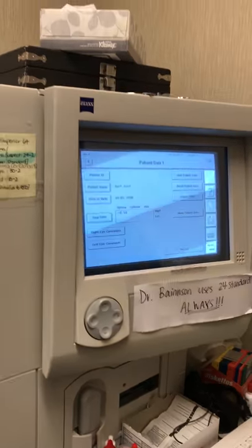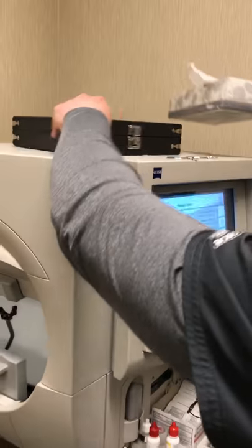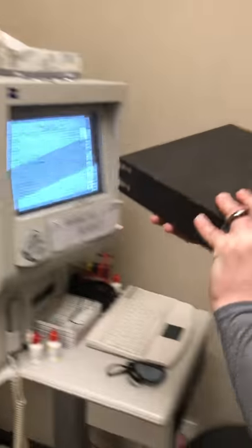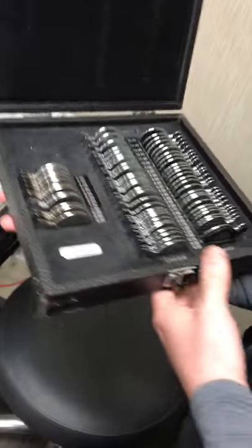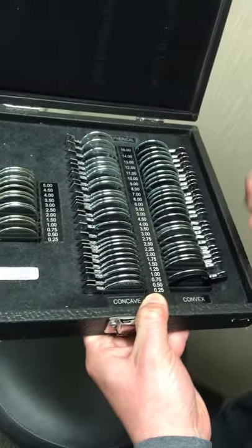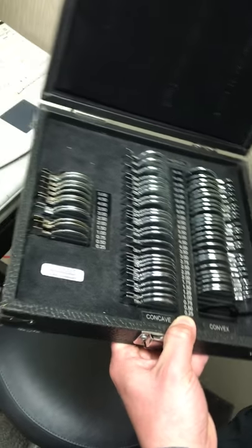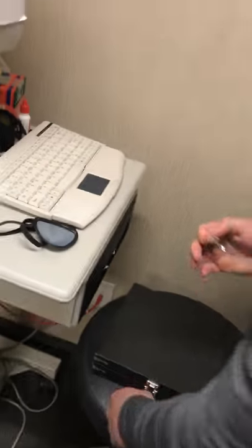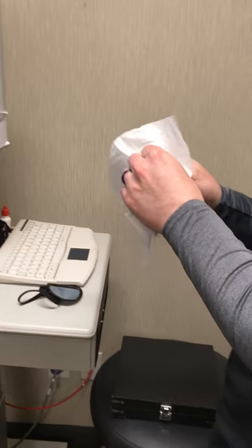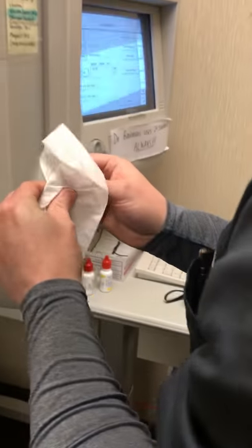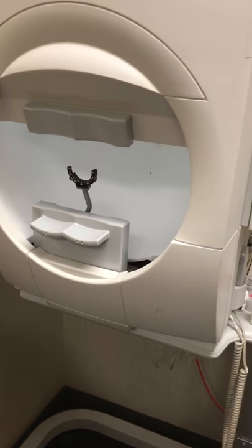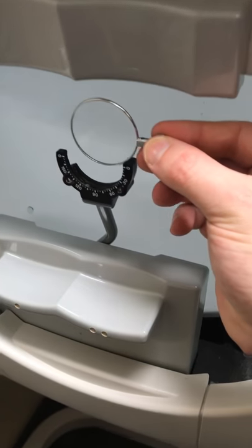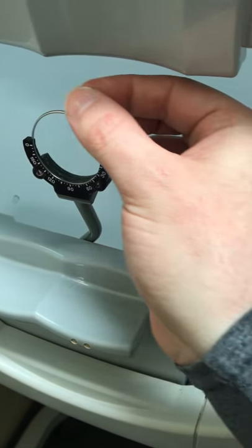In this machine here, we're going to first get all the lenses. This is where our trial lenses are. We're going to use a plus 50 lens. The spherical lens will always go in the front part of the lens holder. I'm going to use a plus 75 in here for her.